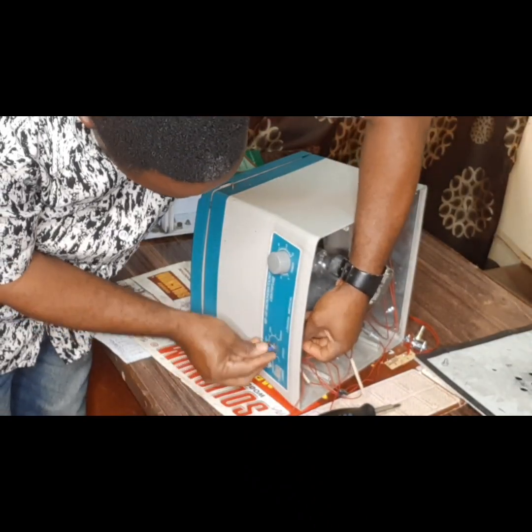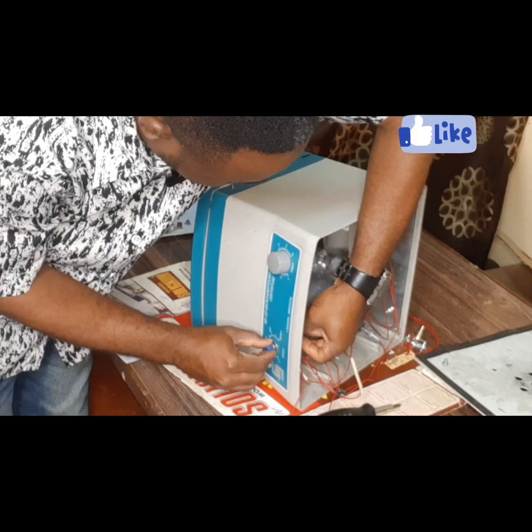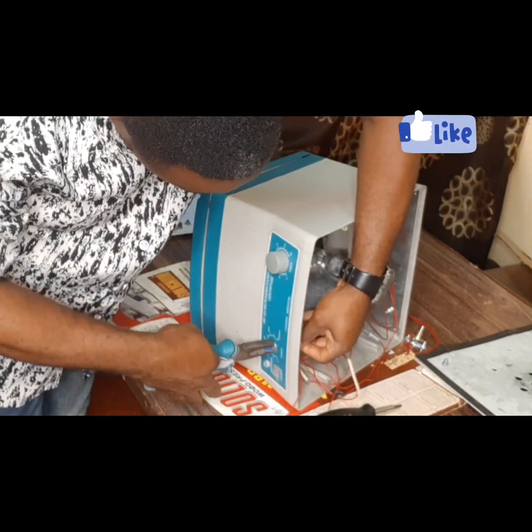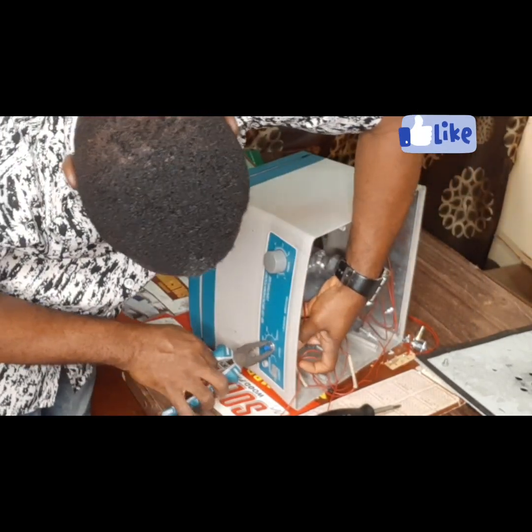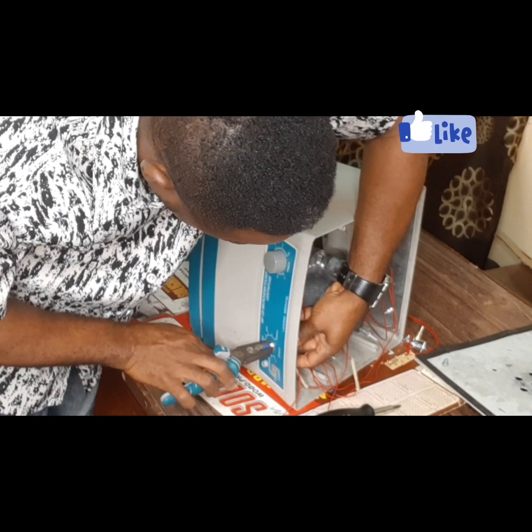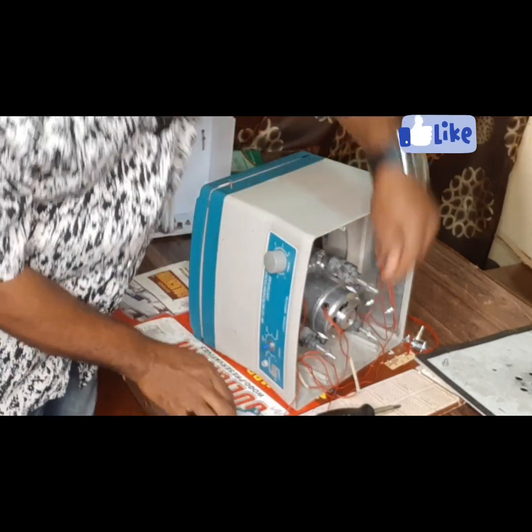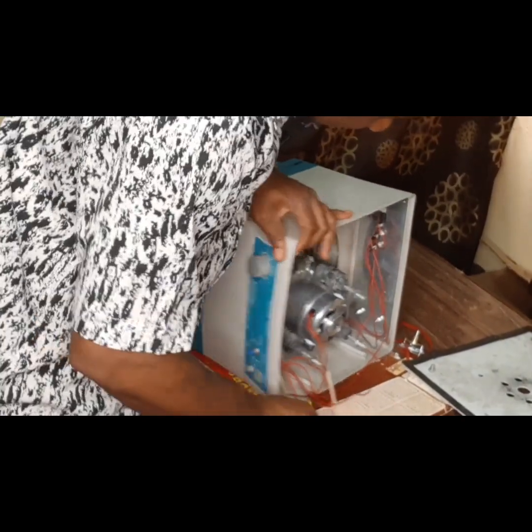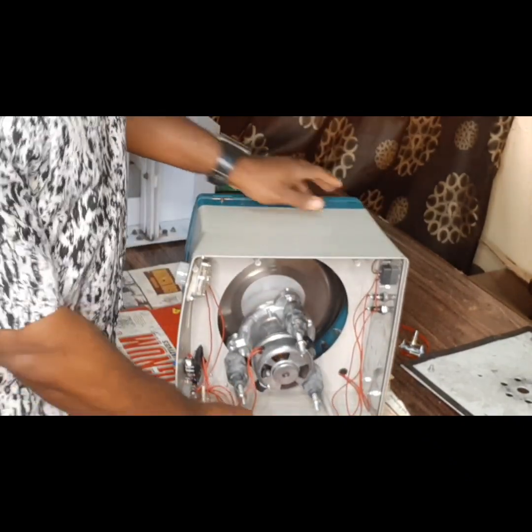Hope you are seeing what I'm doing. Firmly fitted. Okay, you can see I've been able to tighten it in here. So we've been able to effectively fix the regulator in here. You can see it. So what I'm going to do next is to see how to tidy all this cord.